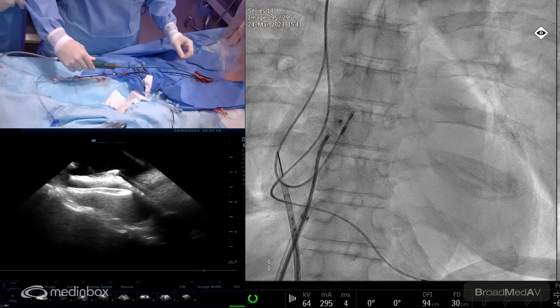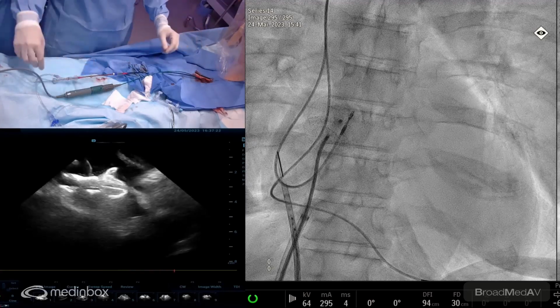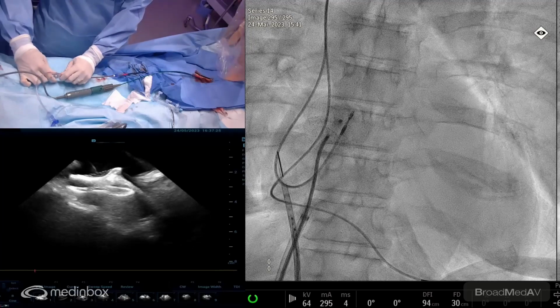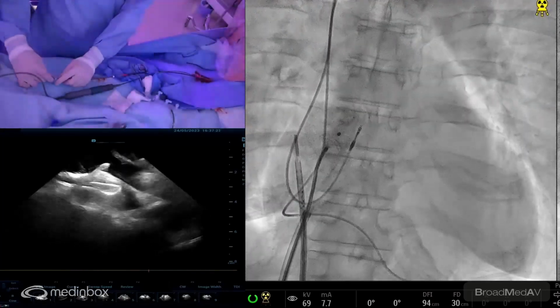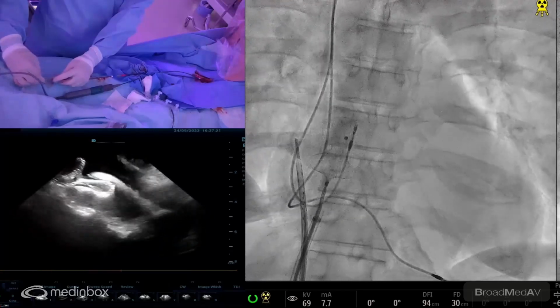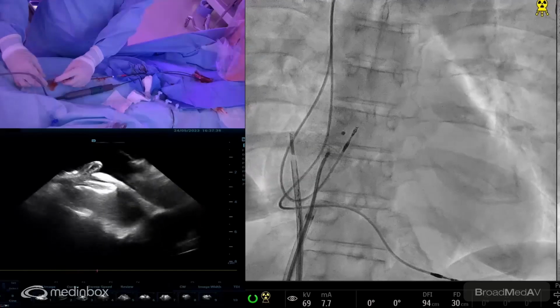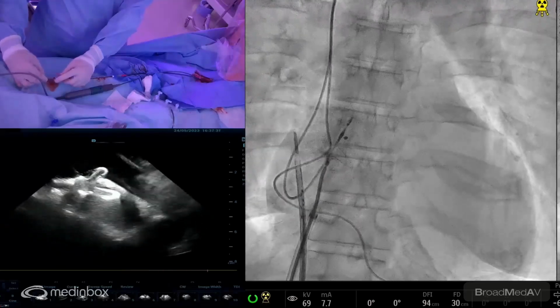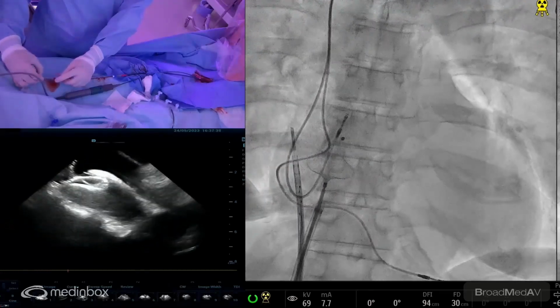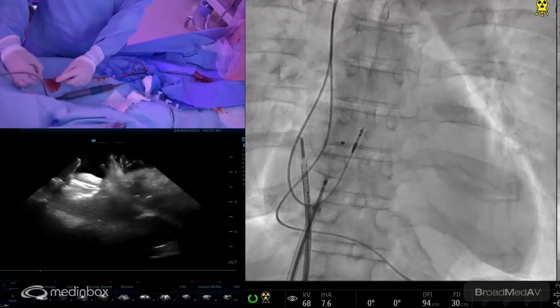At this point, I think we can potentially test the stability of the device. We will pull and push on this device to be sure that it's well attached. So you need to be far with the delivery sheath. Like that. Marcel, you will pull. Yeah, he's pulling now. You see well? He's pulling well the right side of the device, and he will push to be sure the device is stable. Actually, it regains its position quite well.